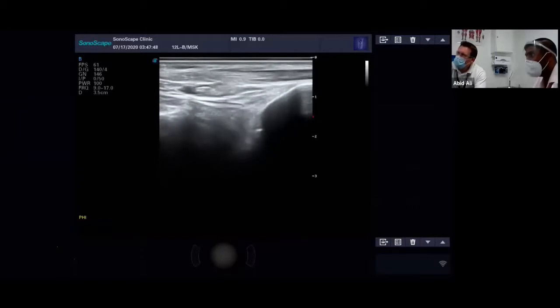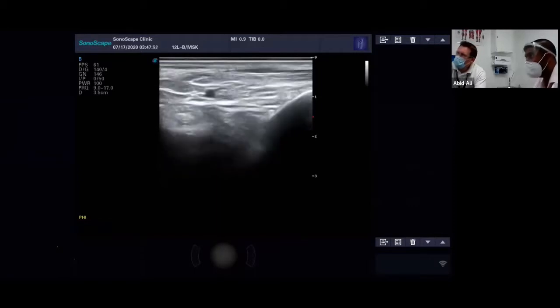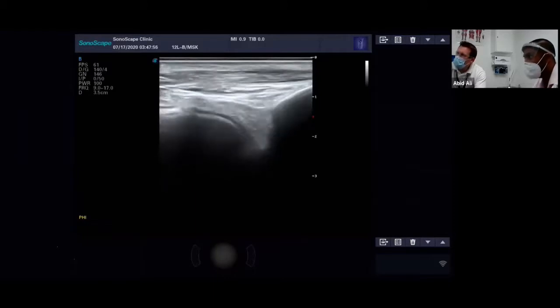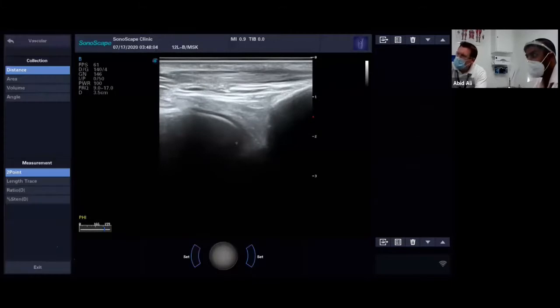But of course, if I've got your ankle mortise too close together, I'm losing the contour of the talus. So you have to plantar flex a little bit to really get a good view of the talus. Oops. Yeah, no, carry on. Yeah. So here.